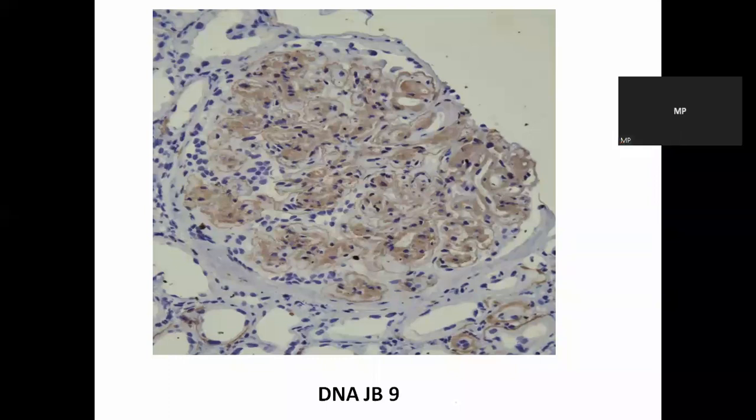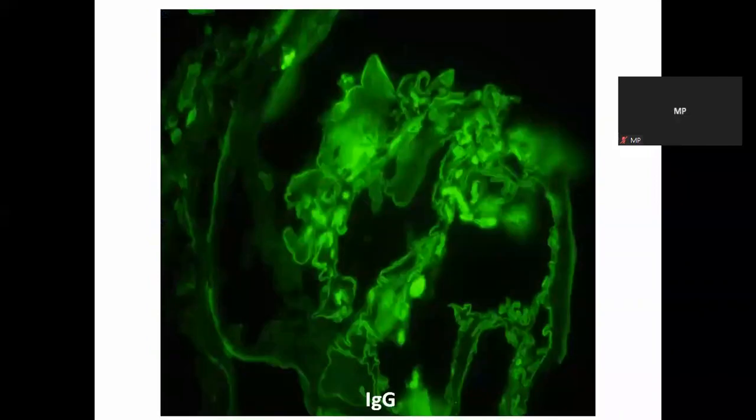Fibrillary glomerulonephritis. Absolutely. So we are dealing with fibrillary glomerulonephritis, which was initially reported from 2 centers as diabetic nephropathy. And I must say that we have started picking up fibrillary glomerulonephritis by doing immunofluorescence. So what we did, the slide which I'm showing you, is a paraffin immunofluorescence we did.